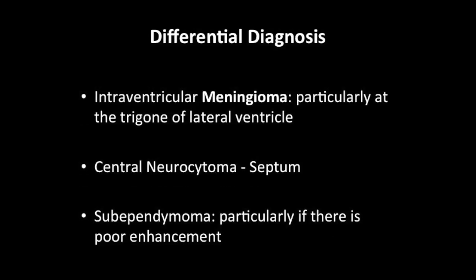The differential diagnosis for an intraventricular lesion within the lateral ventricles includes intraventricular meningioma, which is usually present at the trigone of the lateral ventricle. A neurocytoma usually abuts the septum pellucidum. A subependymoma can be present within the ventricles but shows poor post-contrast enhancement.